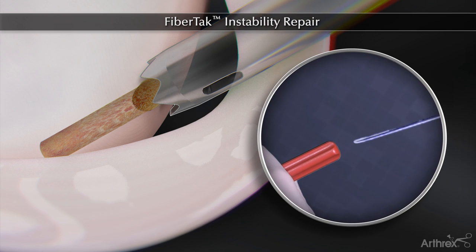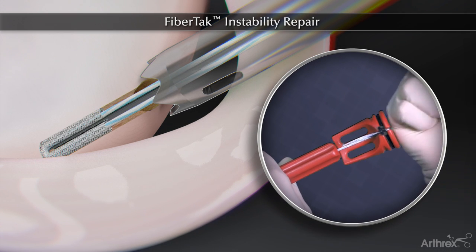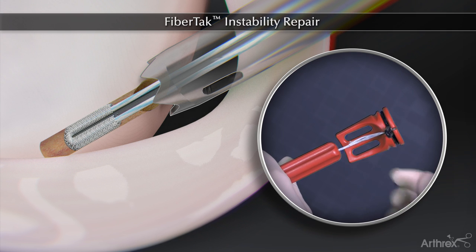Leaving the spear in place, the FibreTac is inserted and impacted until the handle is flush with the spear. The anchor is initially set in the bone by pulling back on the sutures and handle.